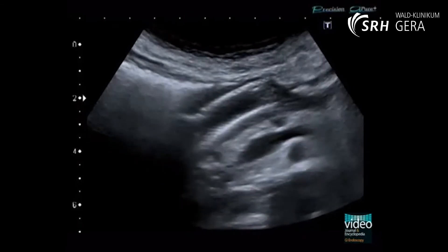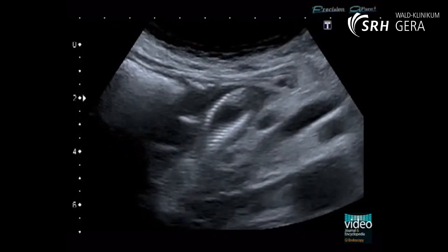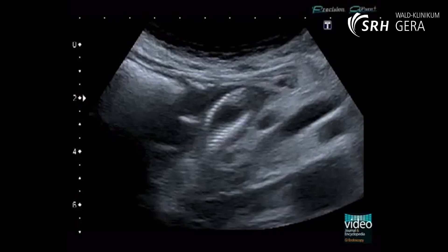On the first post-interventional day, stent position is controlled using transabdominal ultrasound. The intrahepatic bile ducts show normal calibre with aerobilia. The stent itself crosses the duodenum and pylorus, and the distal end can be seen within the stomach. The intervention was performed with peri-interventional prophylaxis using the antibiotic ceftriaxone.